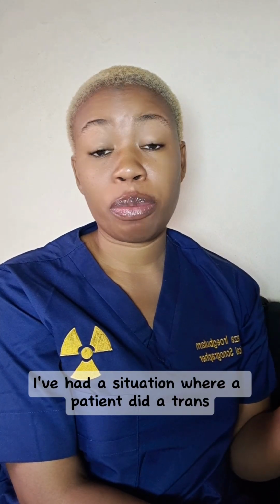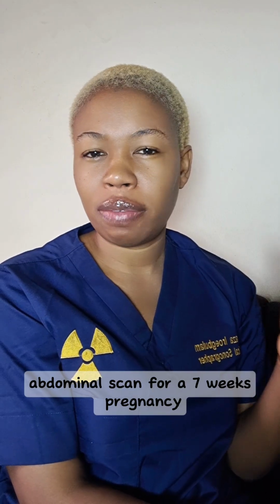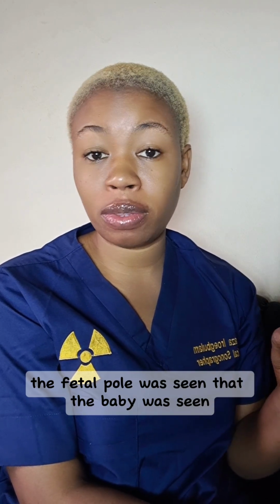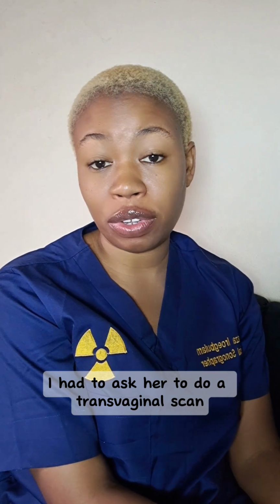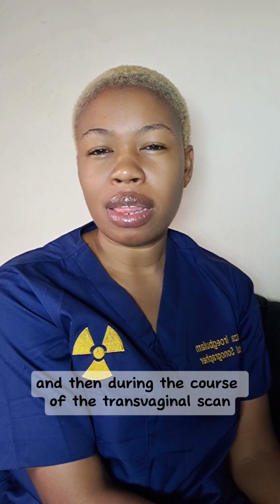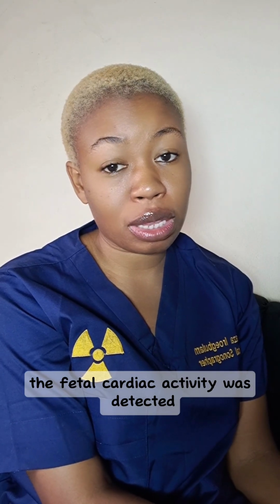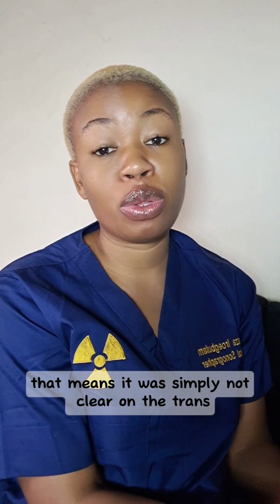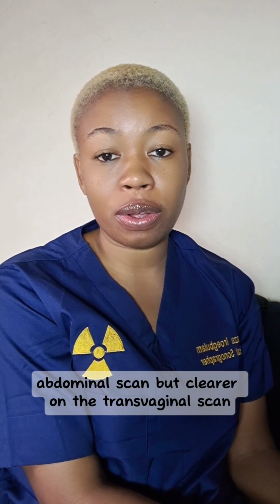I've had a situation where a patient did a transabdominal scan for a 7 weeks pregnancy. The fetal pole was seen, that's the baby was seen, but cardiac activity was not seen. I asked her to do a transvaginal scan for a second opinion or follow-up. During the transvaginal scan, the fetal cardiac activity was detected. That means it was simply not clear on the transabdominal scan, but clearer on the transvaginal scan.